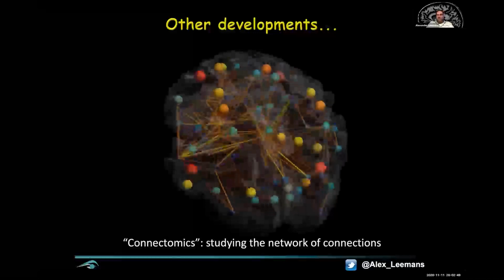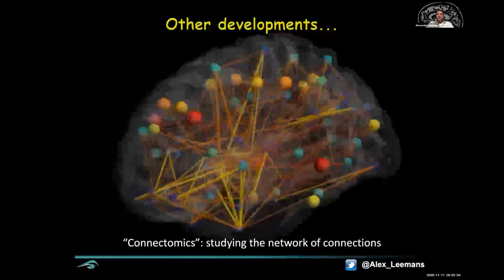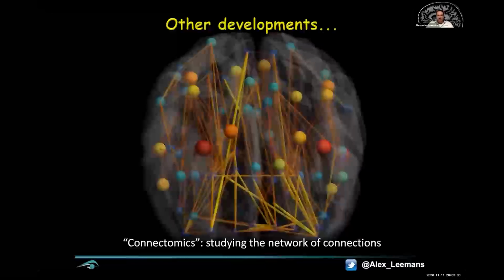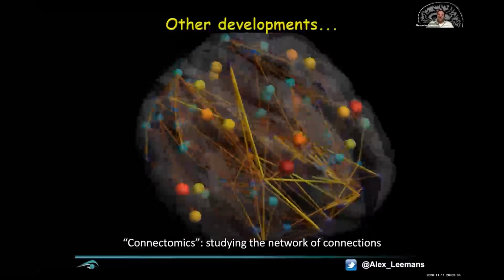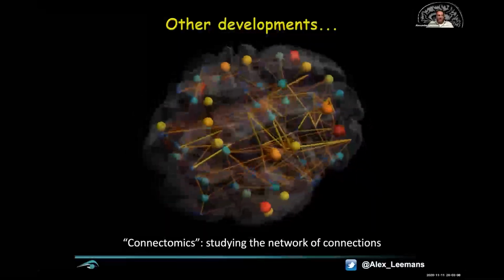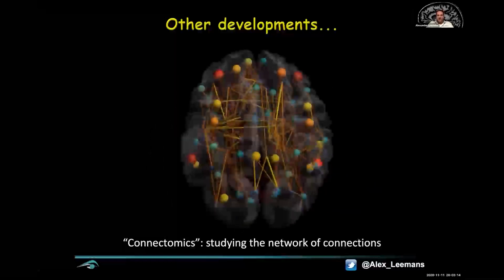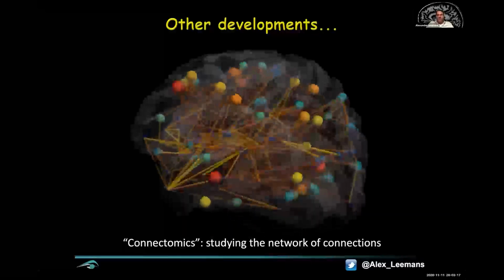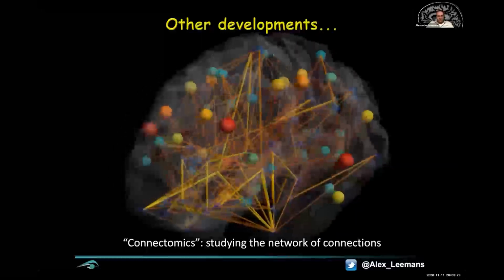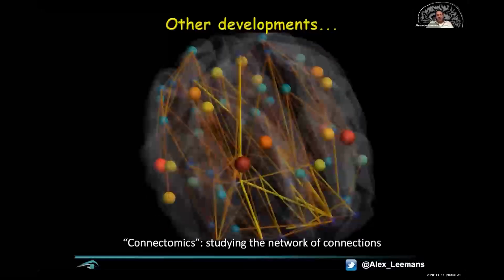And finally, I would like to mention a few recent developments. One is related to, you could call it the Facebook or the Google Maps of the brain. We're looking now at this entire set of connections, right? And we can build up graphs, networks, and look at properties of these graphs, like efficiency or modularity or clustering coefficients, all these properties that we learn from other network science. Think of LinkedIn or Facebook or all these social media things. They literally are based on network theory. And this technology, this knowledge, the algorithms are now being transposed to this set of connections.